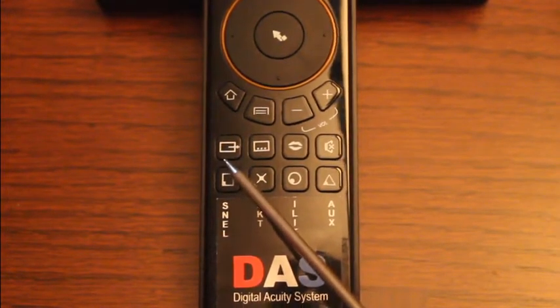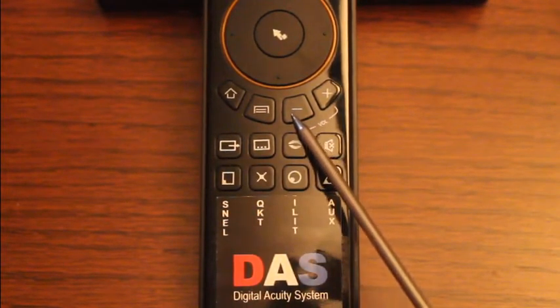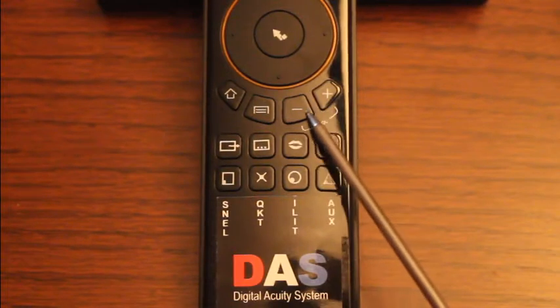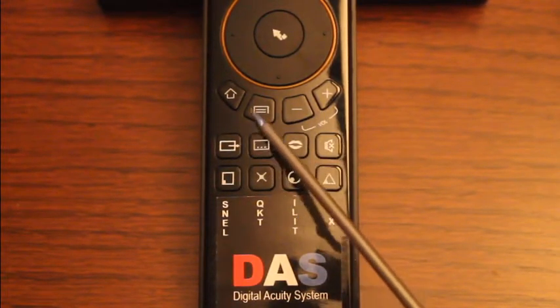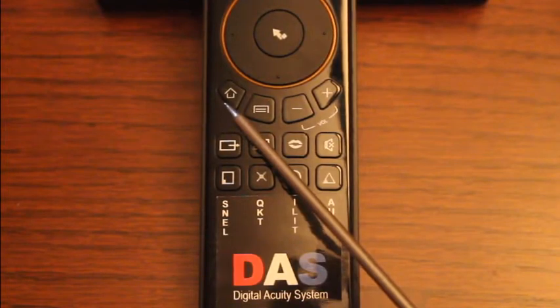This button, represented by a square with a slash mark, is your red-green overlay. The volume control is for adjusting movie sound during movie play. This button of a house is your exit or home button. This takes you to the opening screen where you would make a selection or power down the screen.